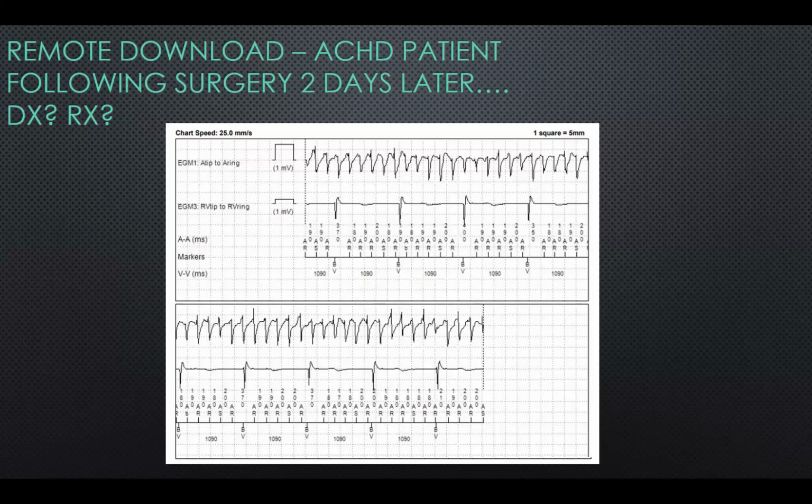And so I think the concern is that because the patient can't tell that they're in it, I would be worried that they could have further episodes that are unrecognized. And unless the patient does a download, we won't know remotely. It just happened randomly that the patient did a download, but they might not have.